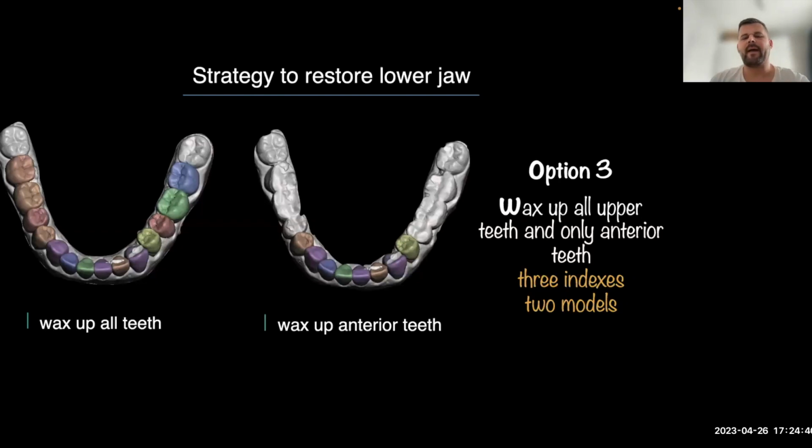It's not a problem. And then you can use, for example, a rubber dam to protect other teeth. It will help you when you restore first of all the anterior part and then start to restore the posterior part.